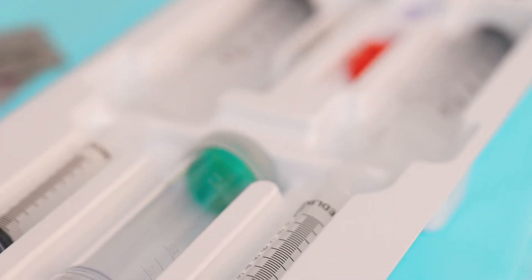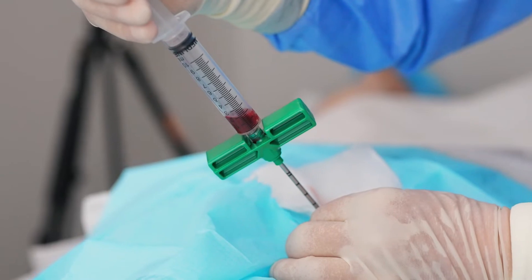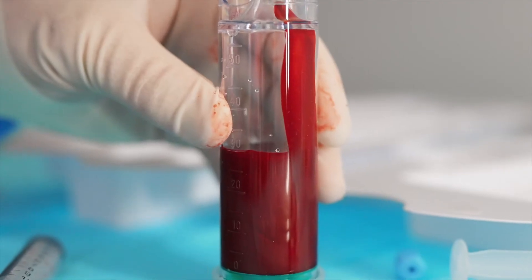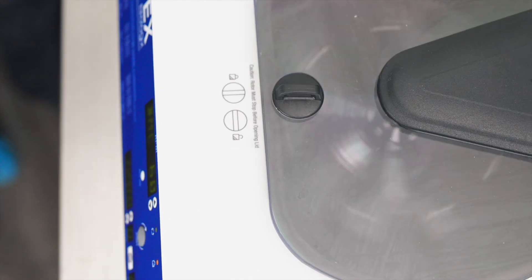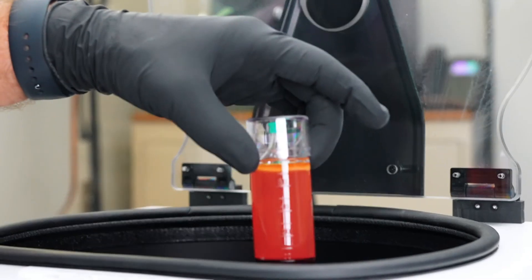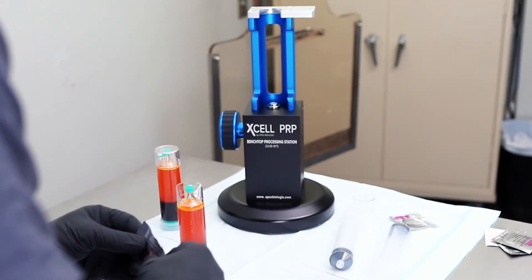At the core of our comprehensive orthobiologics product catalog is our state-of-the-art platelet-rich plasma and bone marrow concentration systems. These systems produce some of the highest platelet and cell counts in the industry. Our products are more flexible, consistent, and affordable than alternative systems.